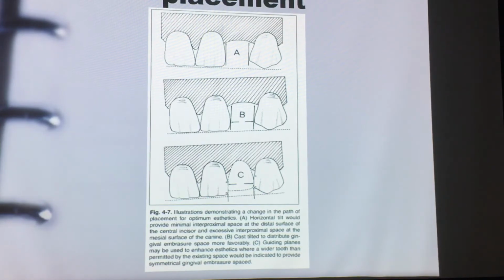So number 1 is we're determining the path of placement with our survey table, and I'll talk to you in the demonstration about how we go about that. For now, I need you to recognize these 9 things and try to visualize what I mean by each one.